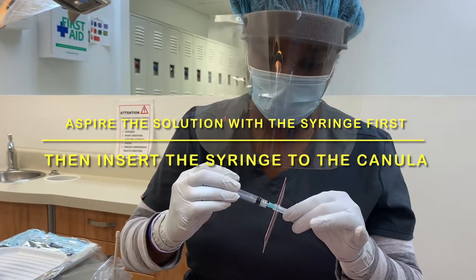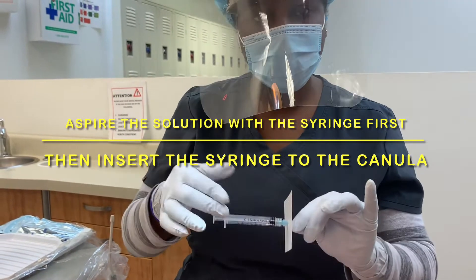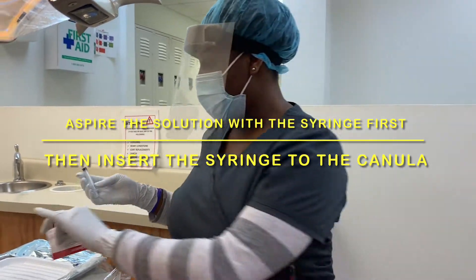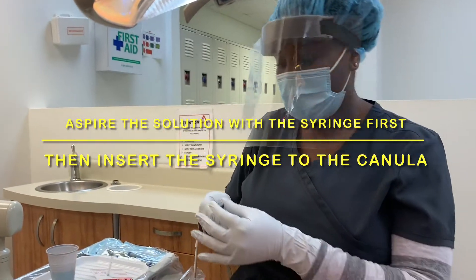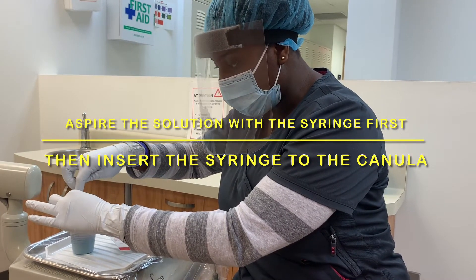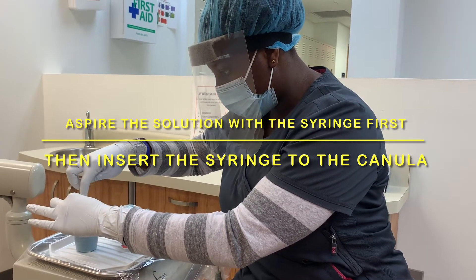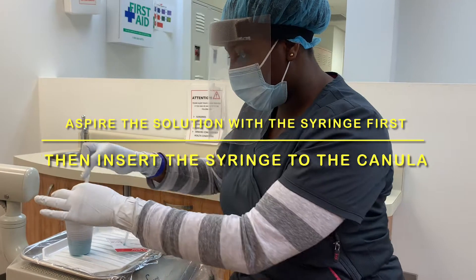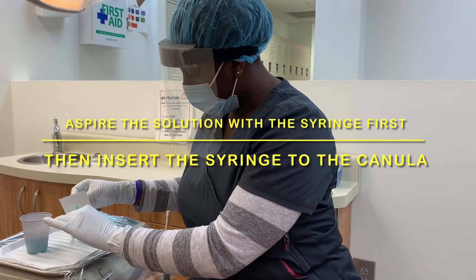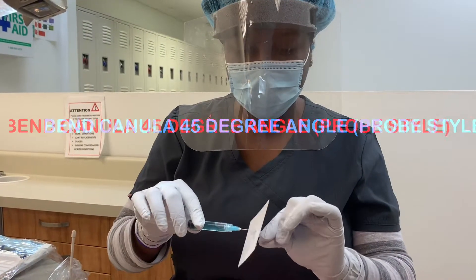I'm going to attach the cannula to the syringe, but it is better to get the liquid — the anti-microbial rinse — first, because it's more difficult to aspirate the agent with the cannula attached. So I'm going to take what is necessary. I'm going to use it on three teeth. Now I'm going to bend the cannula a little bit.